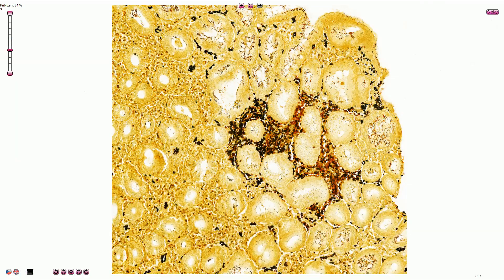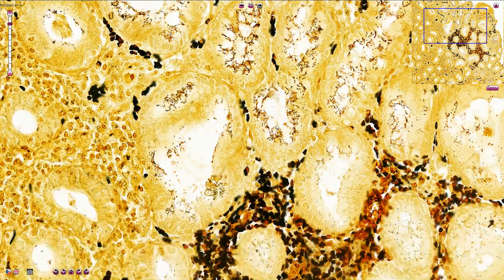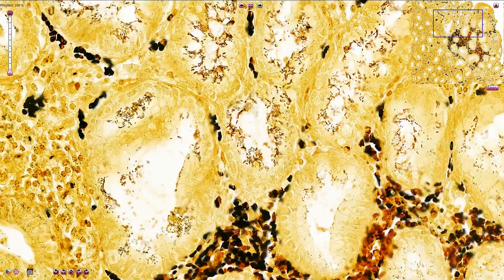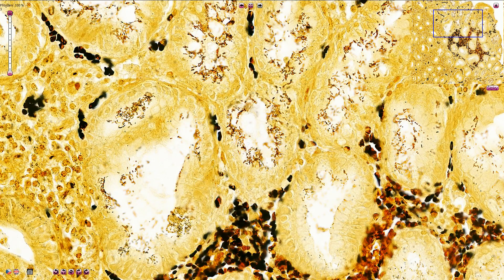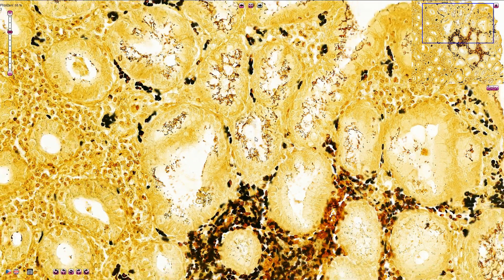This is an example of the Warthin-Starry stain, where H. pylori is visible as a brown to black rod-shaped microorganism or bacillus. All of these structures are H. pylori bacilli. So this is H. pylori-positive severe chronic active gastritis.